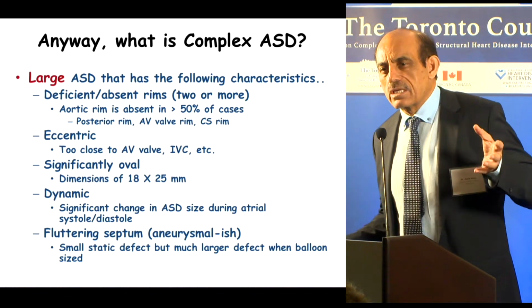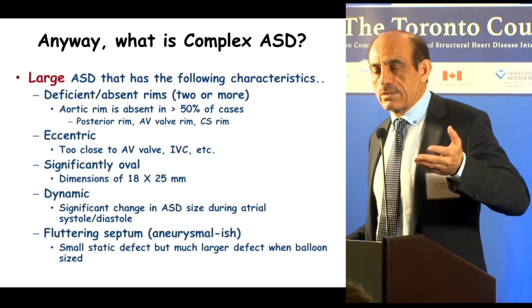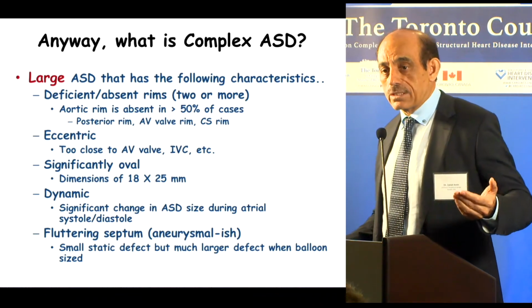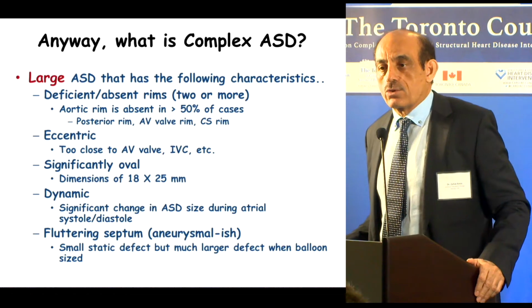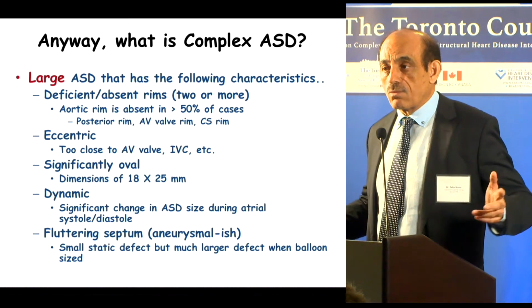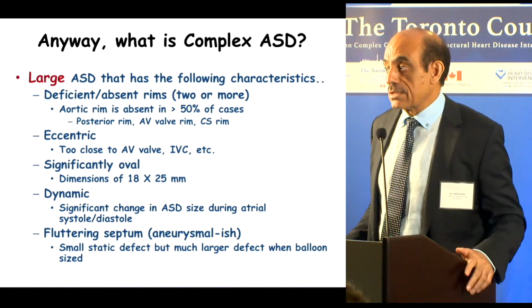Then I'm concerned about ASDs that have different diameters in different views. As Mark was alluding to, 3 standard views of 4-chamber, bicaval, and short axis. And in bicaval, you measure this ASD 25, and in short axis, the ASD is 16 or 17 millimeters. And now it's a conundrum. What size device are you really going to put in this patient, right? So if you balloon size it, even on.